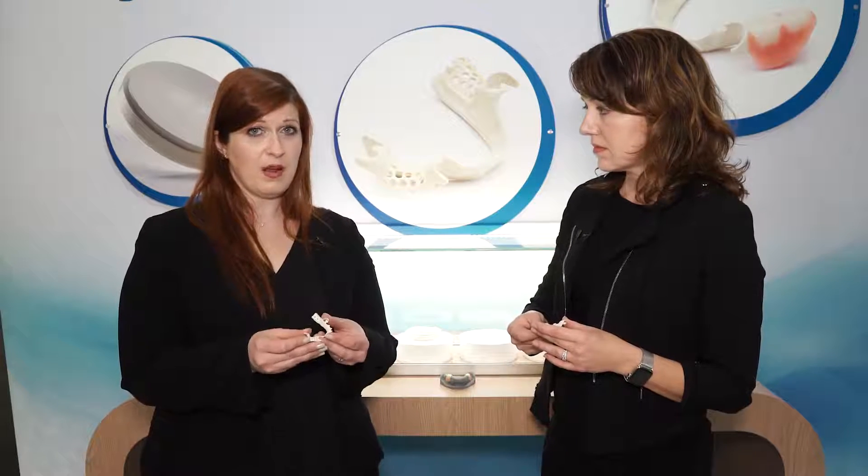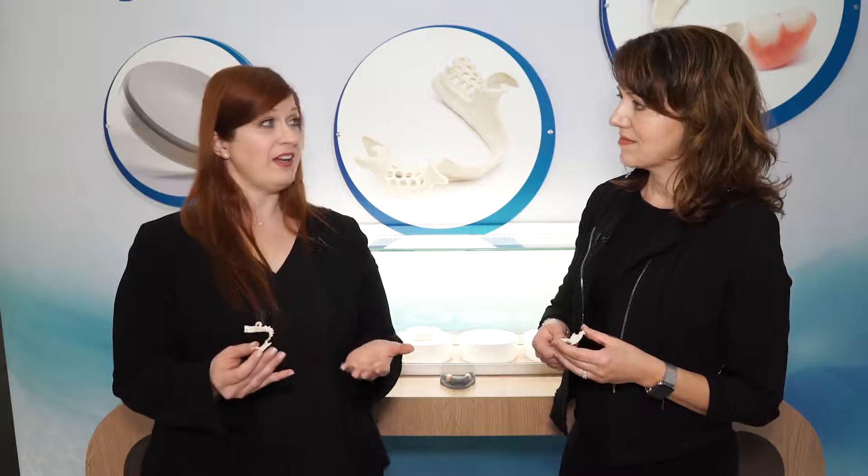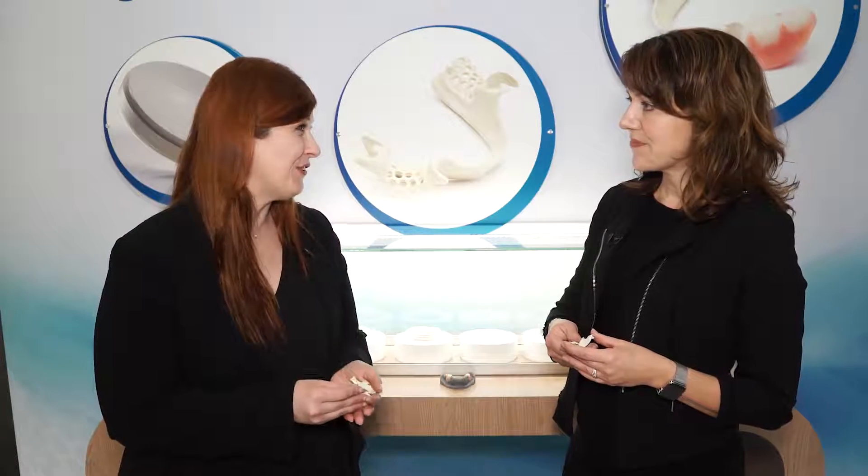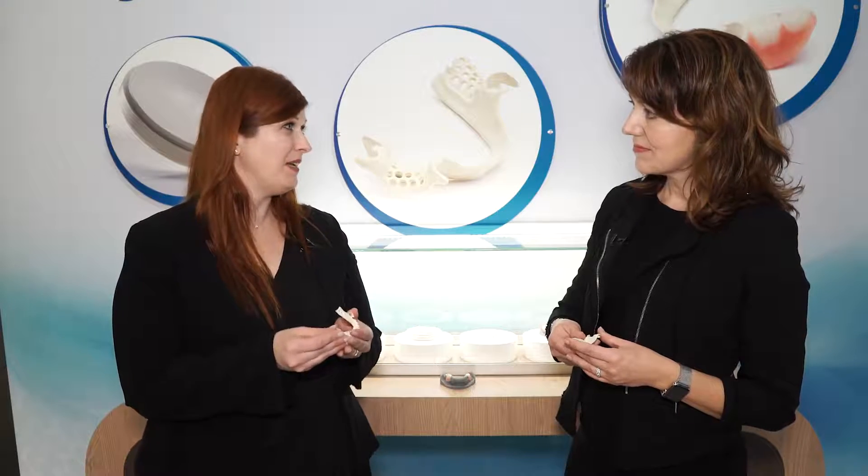So you will provide the product, educate the dental lab, educate the dentist, make it possible for dentists to find the lab, and also provide education that we can ultimately give to our patients. Exactly — sounds like the whole package. Thank you so much for your time and teaching me about this amazing new product.